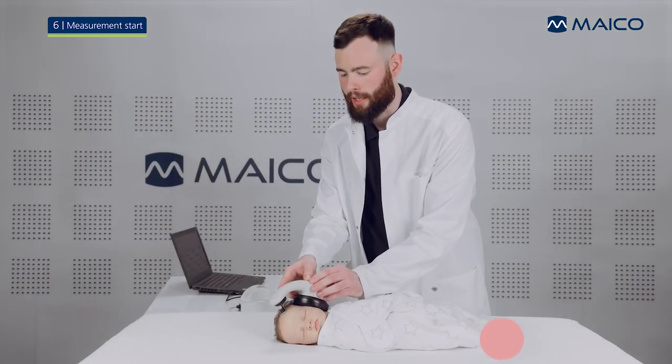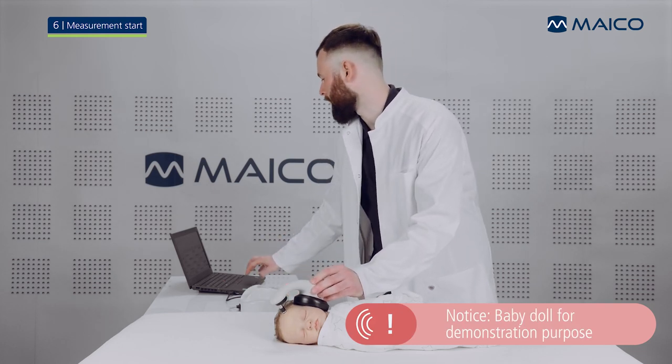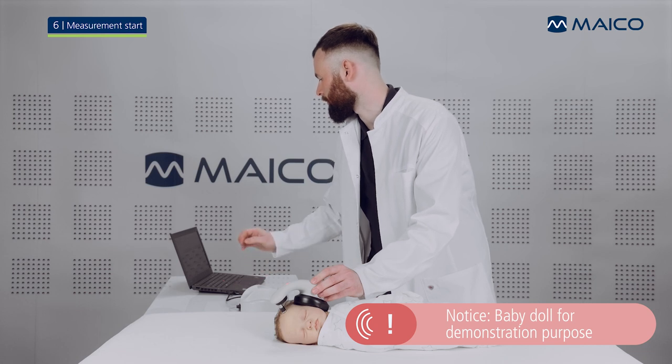When the baby is calm after the placement of the Barafone, start the measurement by clicking the start measurement button in the software.